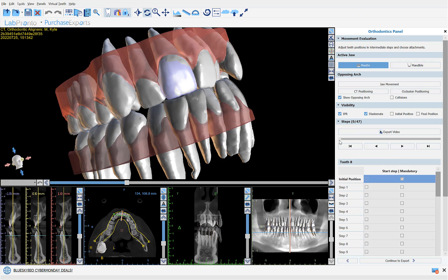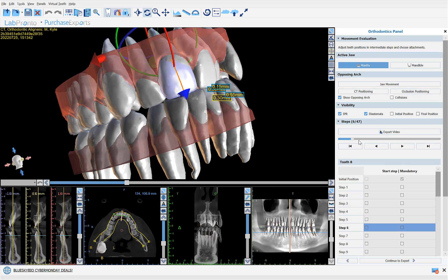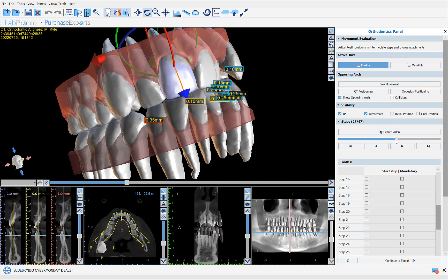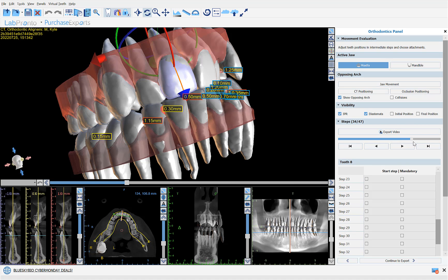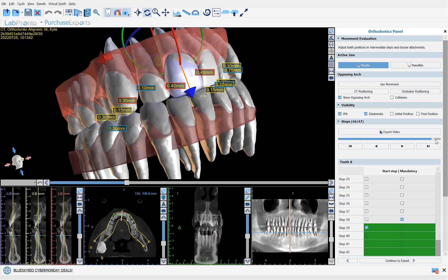As we use the slider to move through the tooth movements, we can see that the teeth are moving along with the roots that are aligned to the crowns from the segmented model.